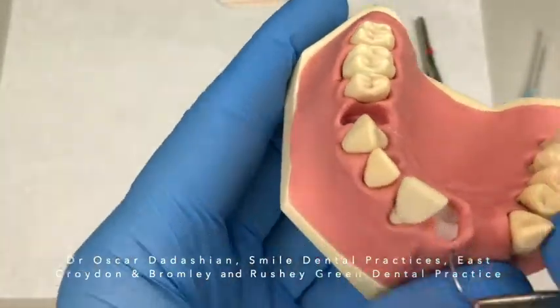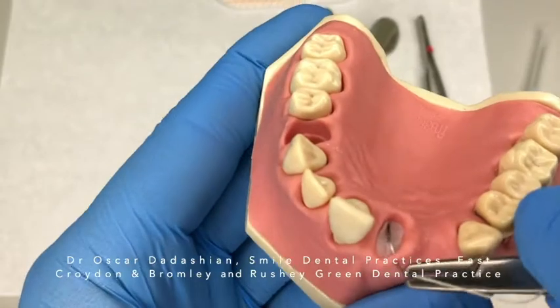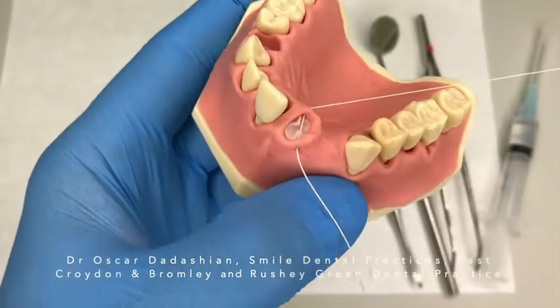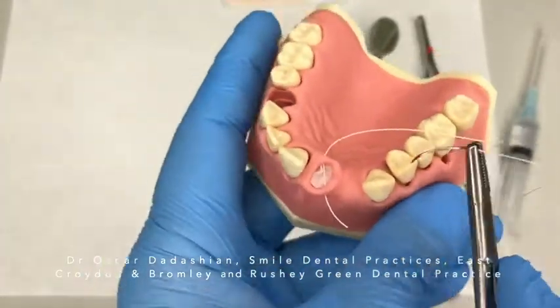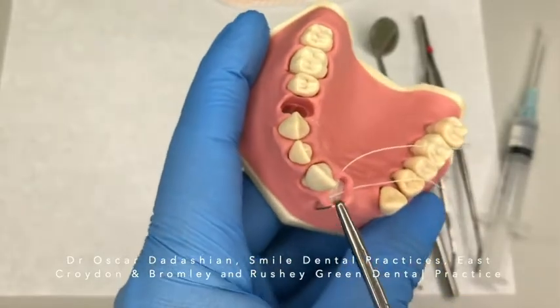Unless you want to put in a PRF membrane on top. I have gone through the disto-buccal part of the flap, crossed it over to the mesio-palatal part of the flap, and crossed it over — so now from the disto-palatal part of the flap crossing over to the mesio-buccal surface of the flap.